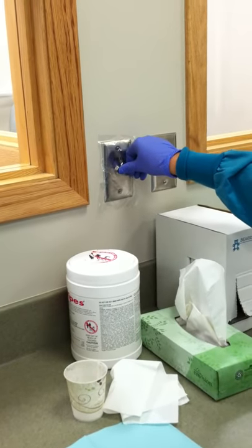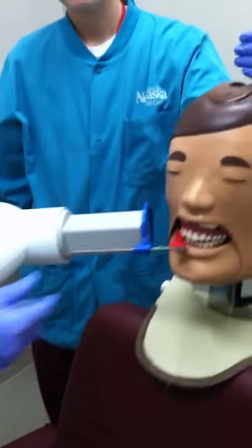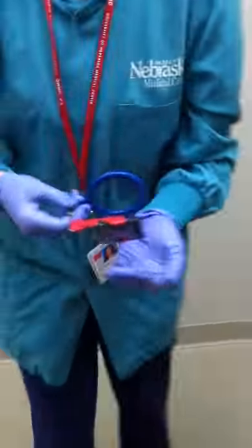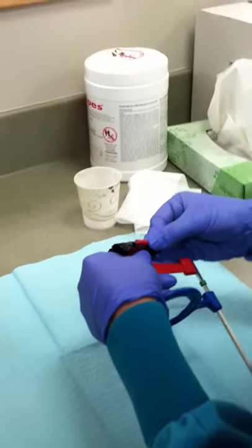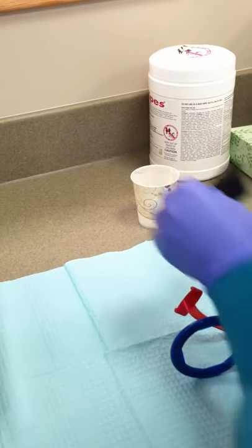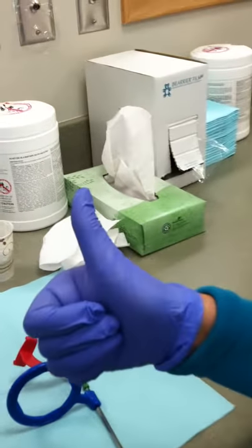Now the operator can step outside of the cubicle and press the x-ray button until you hear a beep and the light turns off. Then remove the XCP from the patient's mouth. Remove the phosphor plate and dry it off with a tissue, and place it in a Dixie cup. Now it is ready for processing.